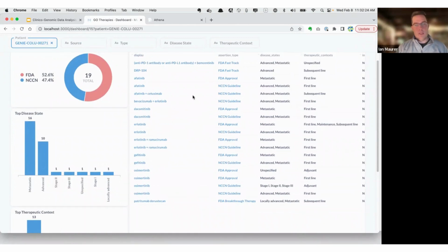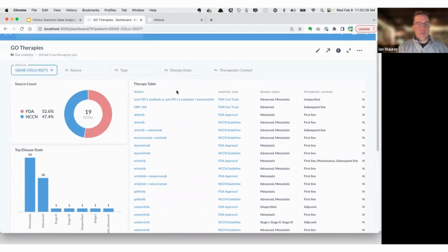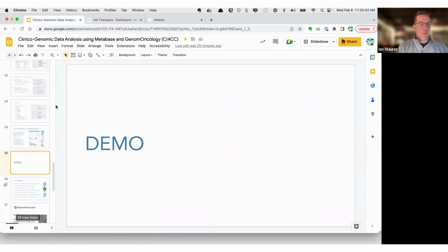Now, this use case doesn't demonstrate match to its fullest capability. There's additional logic that would be on top of this to normalize and sort the information that can then be best presented in our pathology workbench tool or other solutions like Precision Decision. So that's the demonstration.